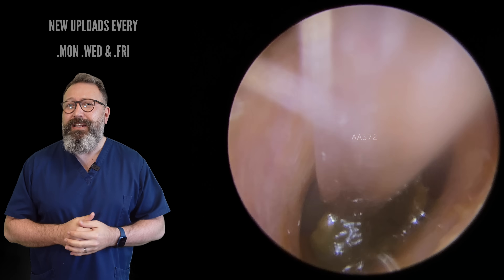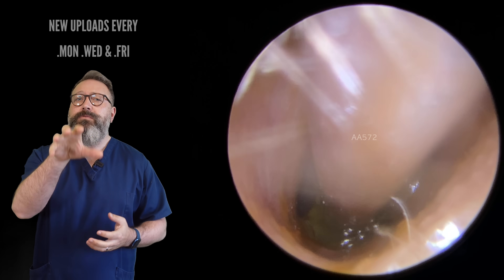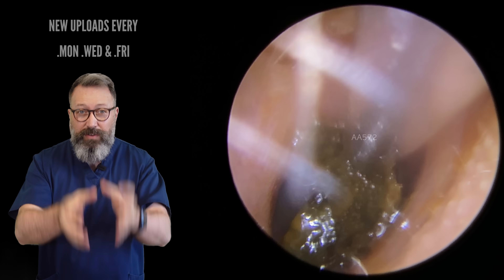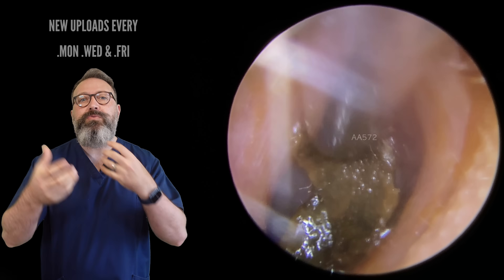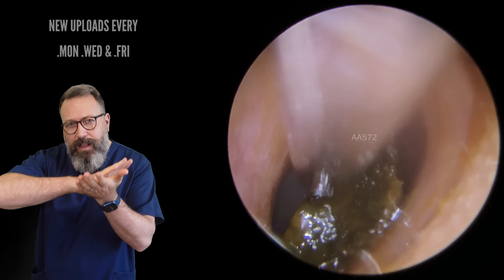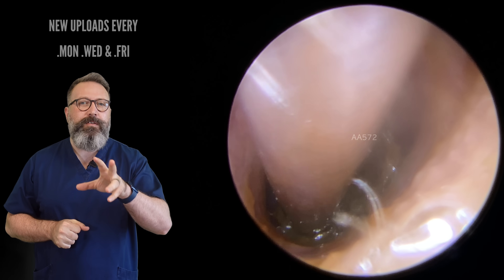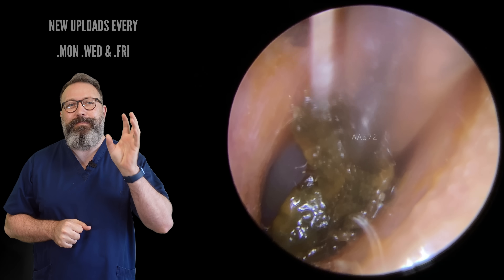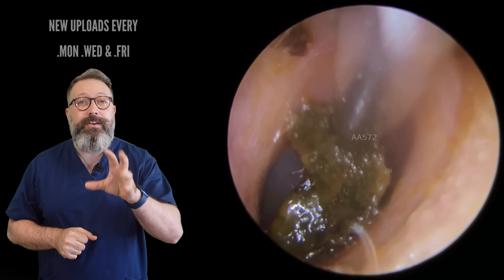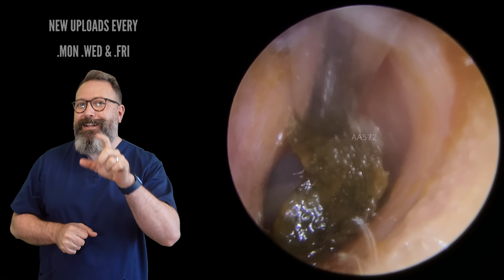You can see I'm going to go really gently with this piece of wax, trying to hold on to this central section. What I've done first of all is put a lot of olive oil in here — get as much olive oil in as we possibly can, because when we do get this piece of wax moving, it's going to slide across that skin a lot easier. Now we do remove a foreign body in this one as well. I did put a post about it in the community tab on Tuesday — lots of really good guesses — and I will tell you what that is at the end of the video.